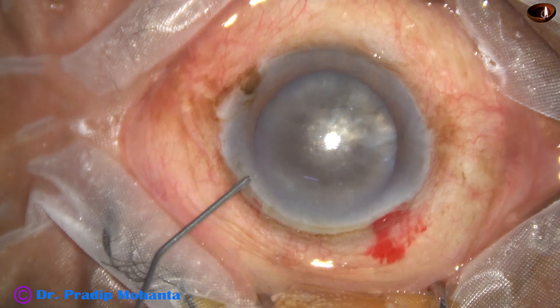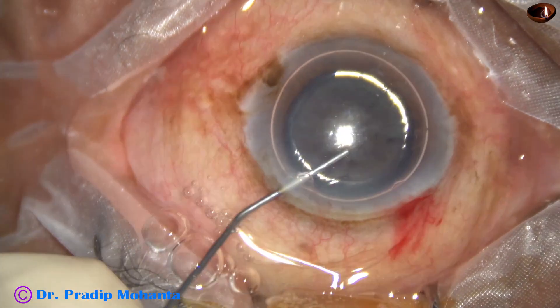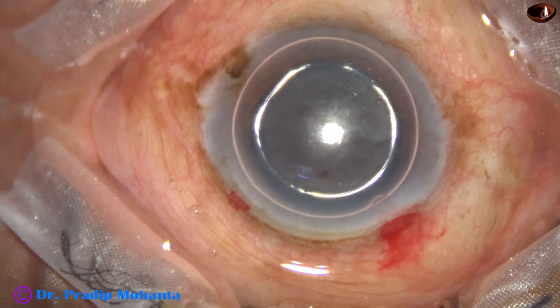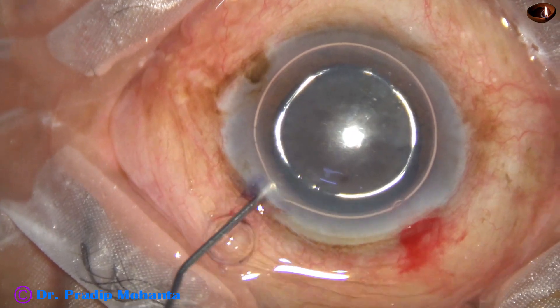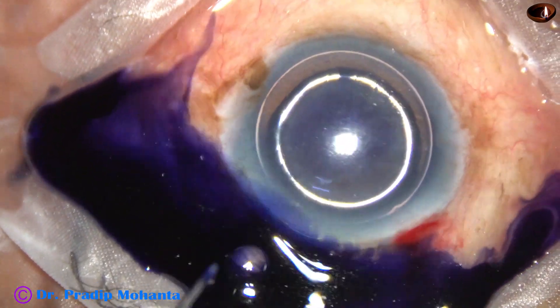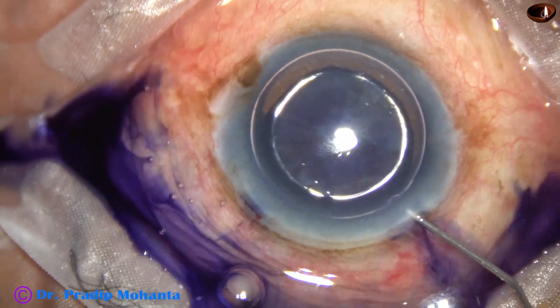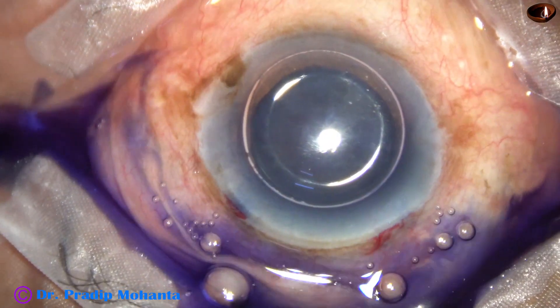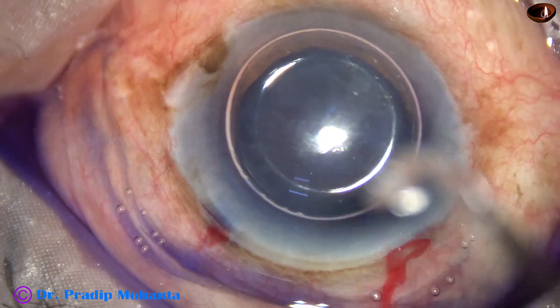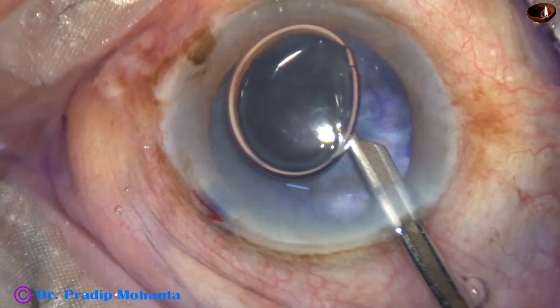And now, an air bubble is injected into the anterior chamber, and beneath this air bubble, trypan blue dye is applied over the anterior capsule. The dye is applied in such a way that it touches all parts of the anterior capsule. This is a bit of adrenaline. And now the dye is washed out using a 23G Simcoe cannula.